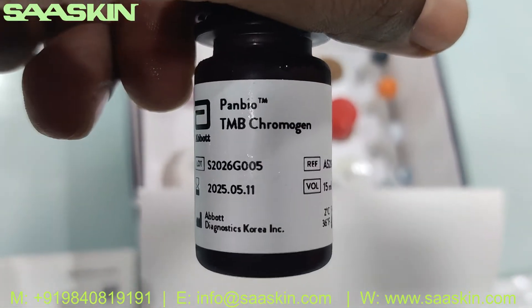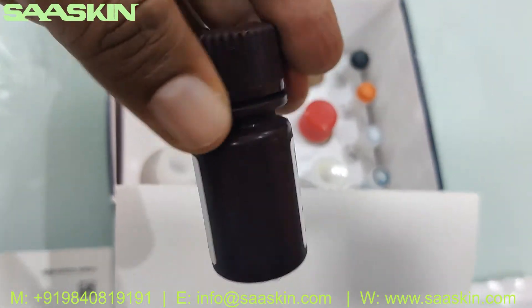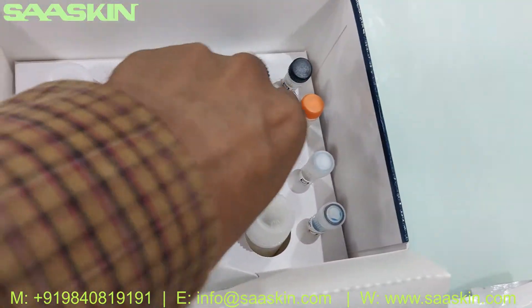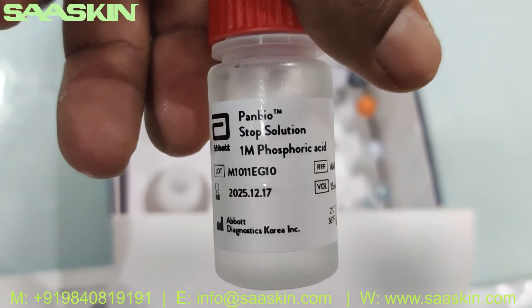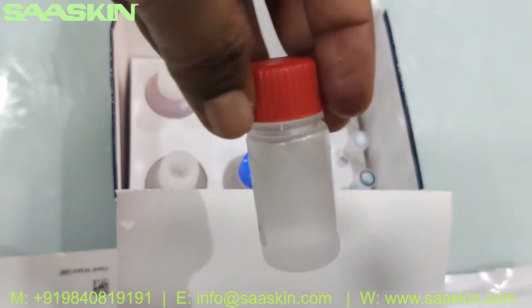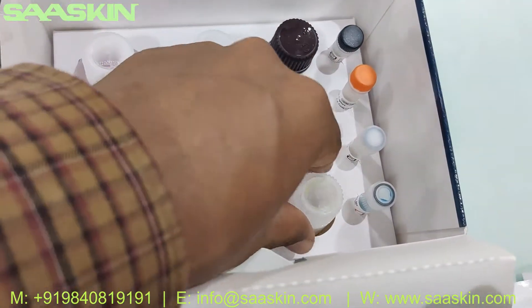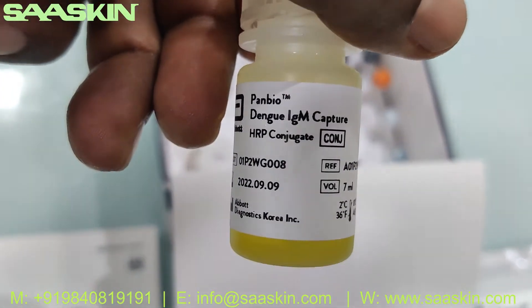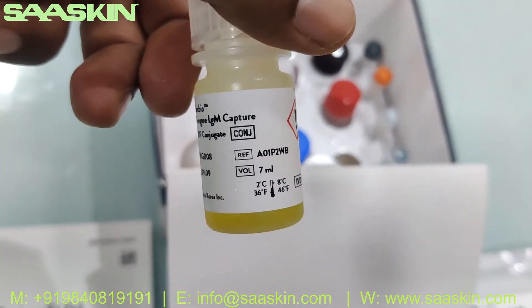You have the TMB chromogen — 15 ml bottle, this is how it looks like. Next you have the stop solution, which is 1M phosphoric acid — 15 ml bottle. And this is the Dengue IgM Capture HRP conjugate — 7 ml bottle.